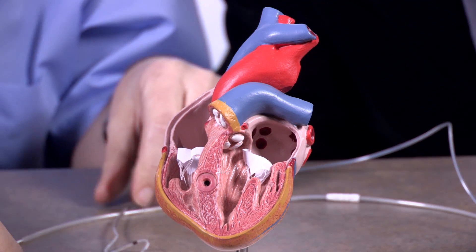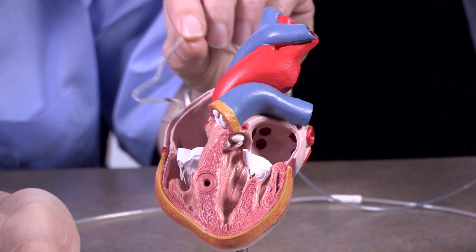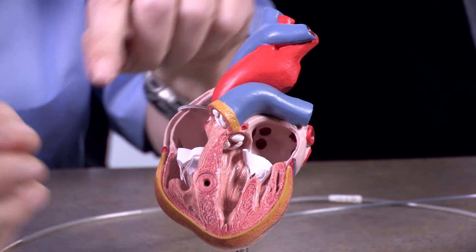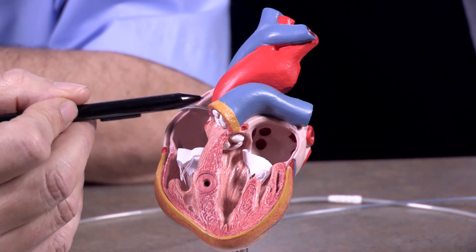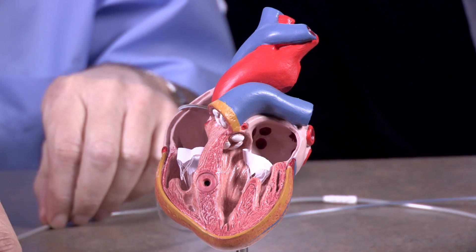So in order to solve it, what we're going to do is design a pacemaker. And there are going to be two types of leads. The first lead we're going to place here in the atria. This atrial lead — this atrial sensor — is going to tell our machine when the atria have contracted. That's the atrial sensor. It's an input.